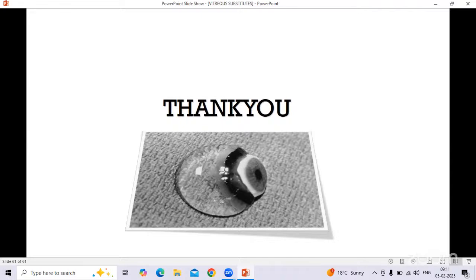Nice presentation. In case of macular hole, which is a good tamponade? Gas, sir. Why gas?